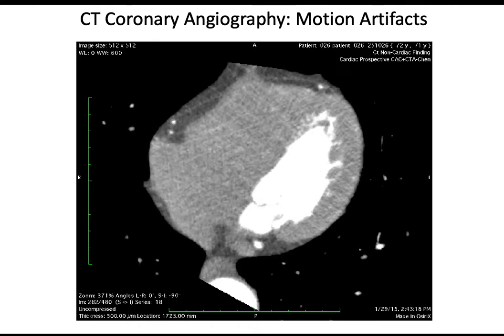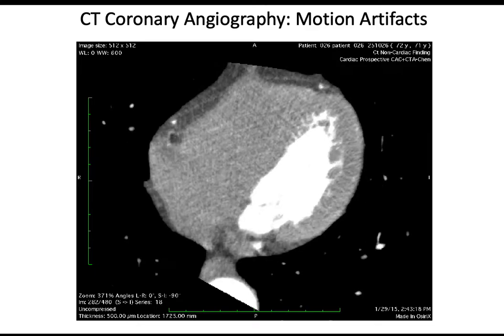And that's what they do. So there's a kind of a heuristic on the machine. It says, I'm detecting all this heart rate variability, I'm going into mode B, which is just to scan for a second. But if your heartbeat was perfectly regular and low enough, it wouldn't actually do it. So maybe you scale it not for everybody, but for the people where you're at a higher likelihood of missing the right phase of the heart.